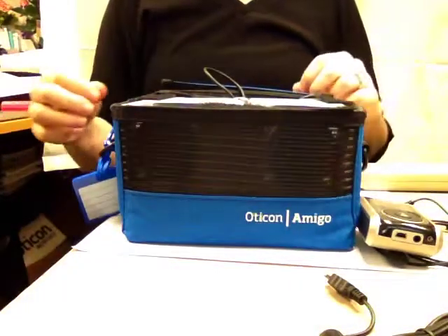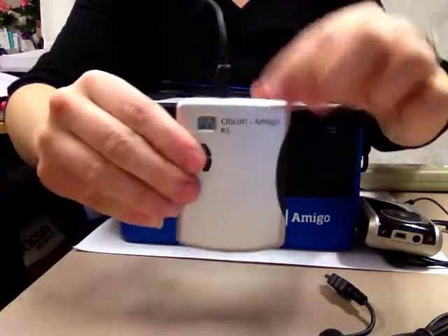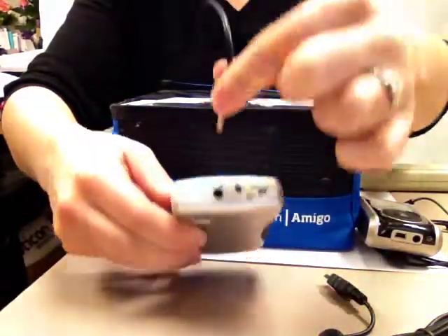The Oticon R5 receiver should be attached to the Amigo Desktop by a cord that plugs into the headset jack on the receiver.